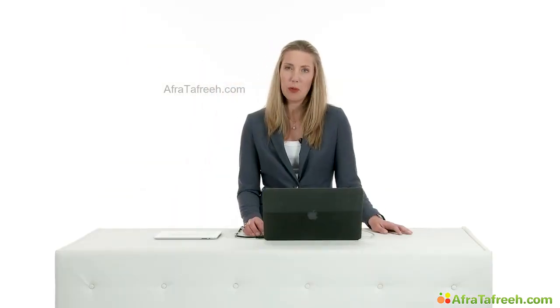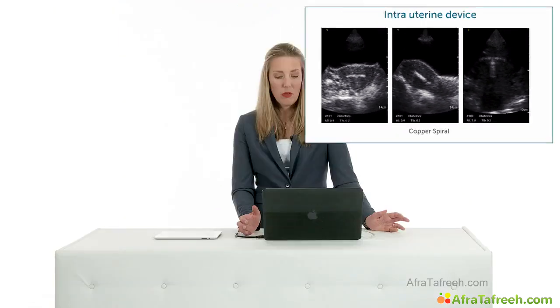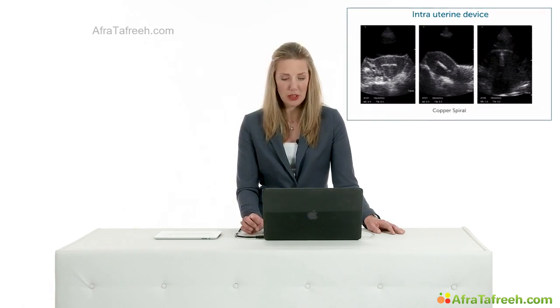What other things can we come across in our practice? That's, for example, an intrauterine device. In most countries, general practitioners can place them by themselves, but what do they look like if you want to see if it's in the right position? For a device with hormones, it's not very important to check, but with a copper spiral, you want to be sure that it's in the right position.